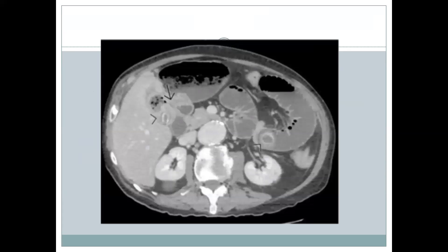This is an axial contrast-enhanced CT. You can see the gallbladder and the duodenum, with a fistulous communication between the two. There is a partially calcified stone in the gallbladder, and in the small bowel, in the jejunal loop, you can see another migrated gallstone resulting in a distended proximal bowel loop with air-fluid level.